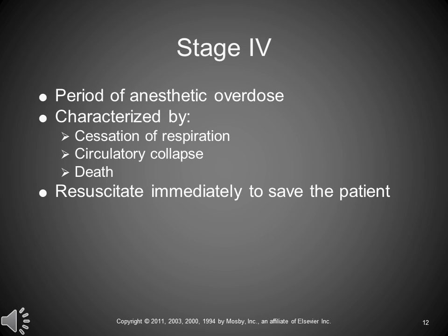I've seen this a couple of times. The worst case, I think, was in a procedure. Student wasn't paying attention. It was time to wake the patient up. We said, okay, now you can turn the vaporizer off. And the student, not paying attention because she was watching something else, instead of going to 0 or to off, turned it to 5%. And the dog just kept going deeper and deeper and deeper, and frankly, we started wondering what was going on. Dog got to stage 4, on the verge of death, because the vaporizer was set at 5%. Wasn't paying attention. So, stage 4, bad stuff.